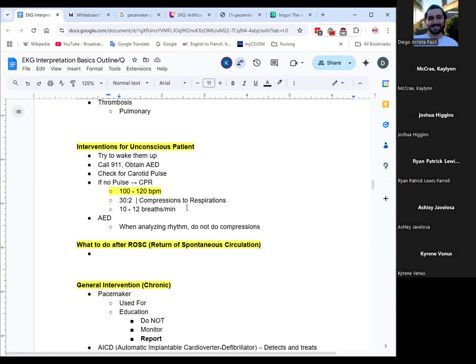Yeah, the big old red signs. Some have a button and then you pull it. Some you have to push it in and then pull. I don't remember how the ones at the skills lab are, but every hospital is slightly different. Is it push and pull at school? Okay, there are two buttons, but you only have to press one. People were trying to press both and couldn't do it, because if you press one, it pushes the other one to the side. So it's just push one, pull.